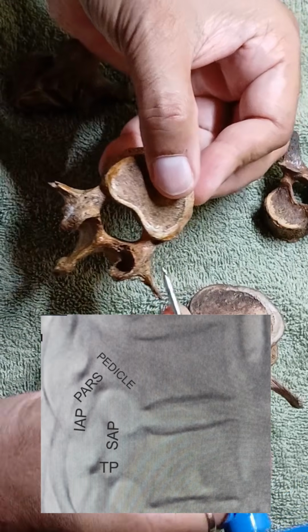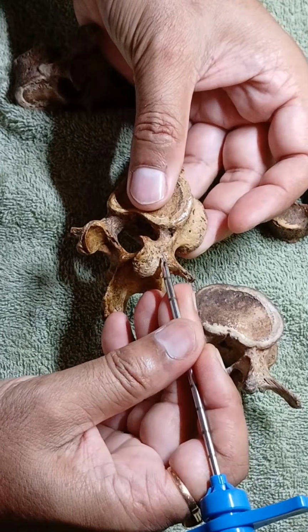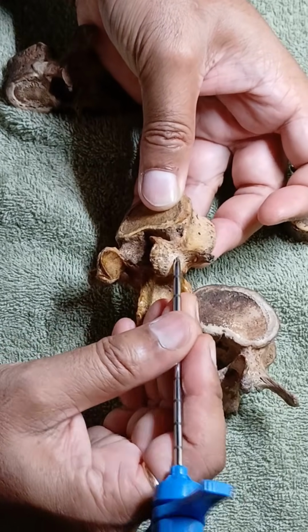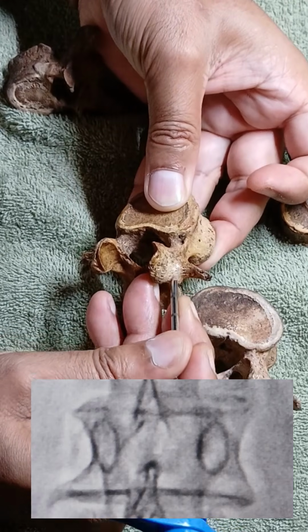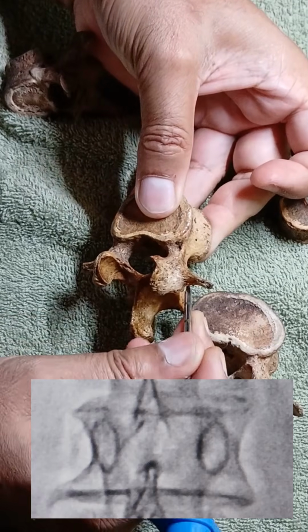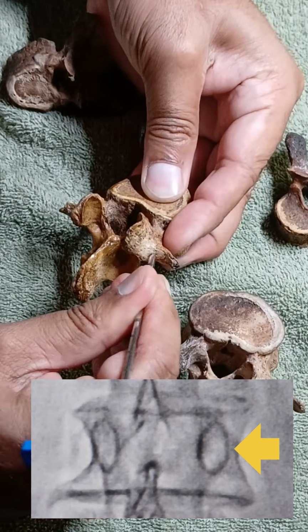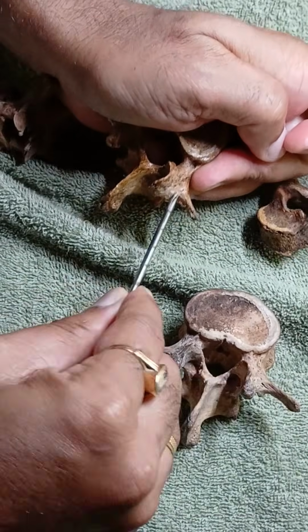So this journey is so crucial. Once you go inside, you cannot come back. Mostly here, where the transverse process and the accessory and mammillary processes come at this level, we get the entry point at the lateral pedicular line. So in this irregular area, I have to take the first bite like this.